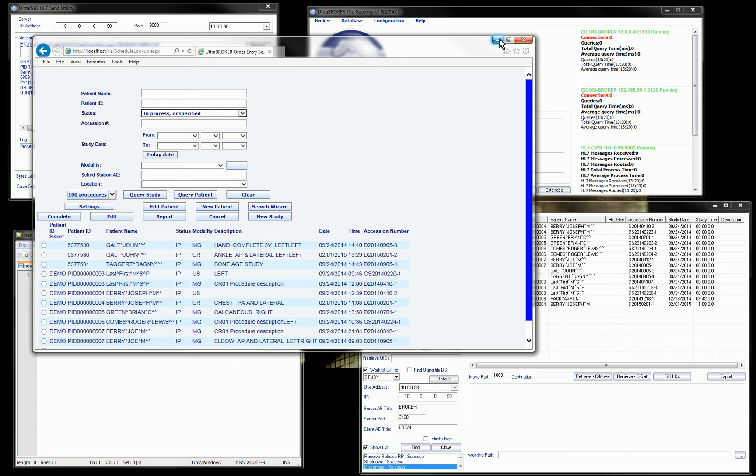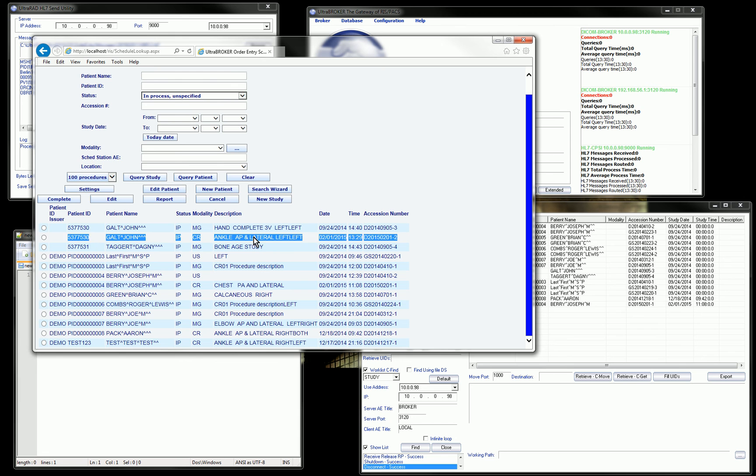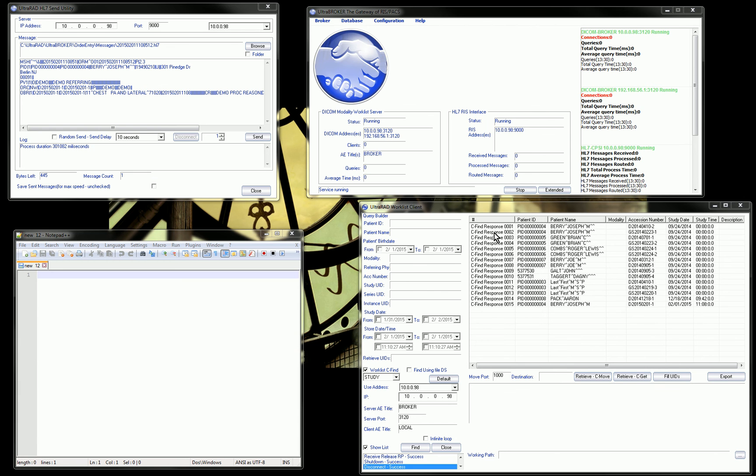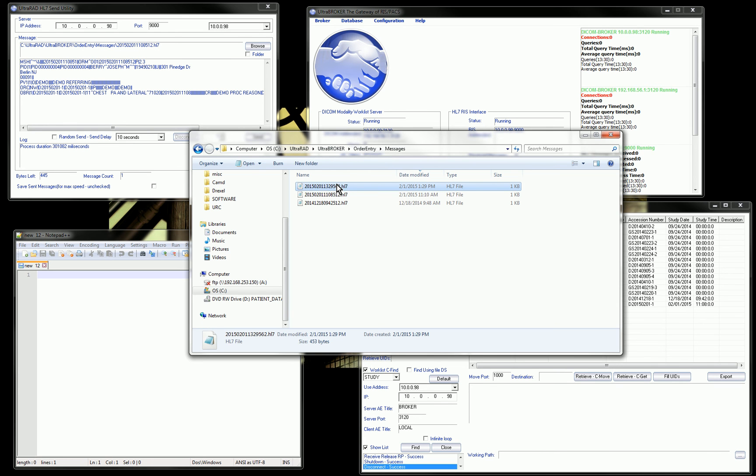Let's go and take a look at that order that just got generated. Here's my order. It has today's date. Today is February 1, 2015. Here's my order for John Galt. Now, if I go and look in my folder where my HL7 messages are stored from this RIS, here are my HL7 messages. This right here is the one that was just generated.